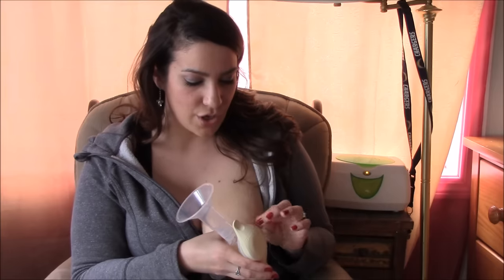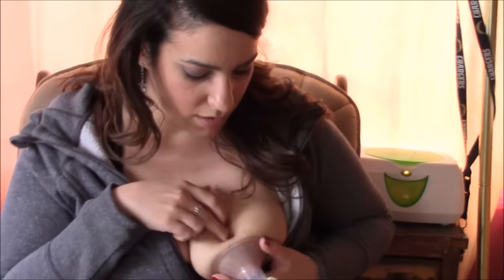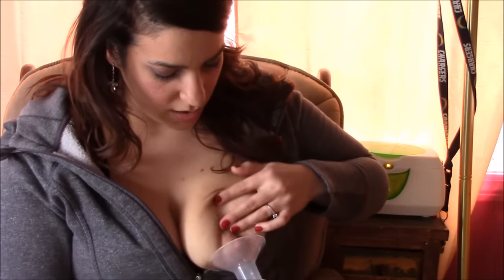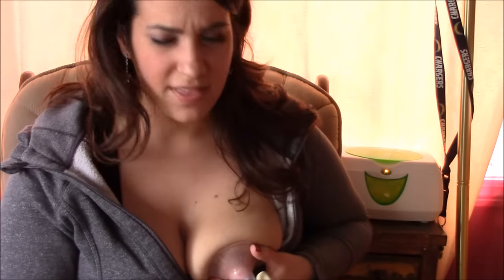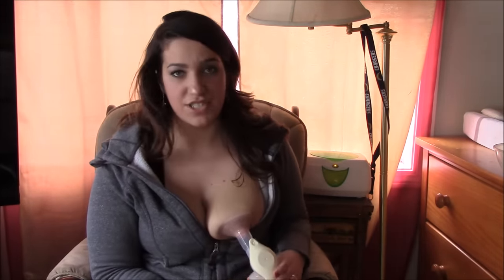First we'll use a pump — this is the Medela manual pump that came with my breast pump. I use this to stimulate my milk supply and also to make my nipple more prevalent. If you have flat nipples, I think this would really help, because it makes your nipple more erect and easier to use the nipple shield. You just center your nipple in there, make sure it's not touching the sides where it will rub.